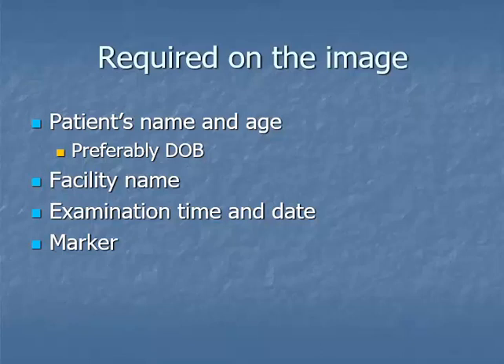The likelihood that you're going to have two patients in the same hospital facility with the same name, on the same time and date, where you have the same exam, is still possible. Happens not quite all the time, but it happens. I've gone to a floor with a portable machine and taken an x-ray on two different patients with exactly the same name. The likelihood of having a patient with the same name and same age in the same facility with the same examination time and date and having the exam taken by the same person is pretty rare.